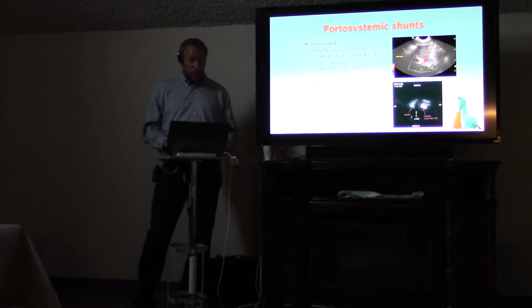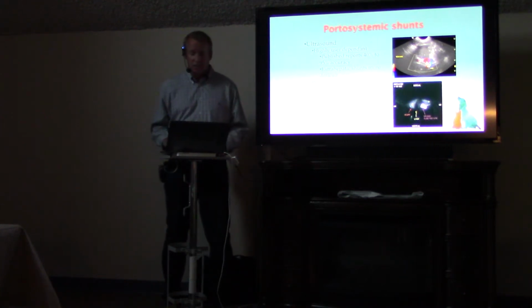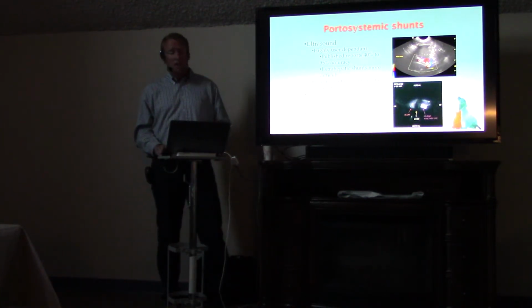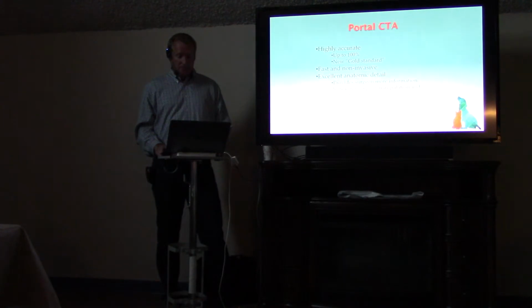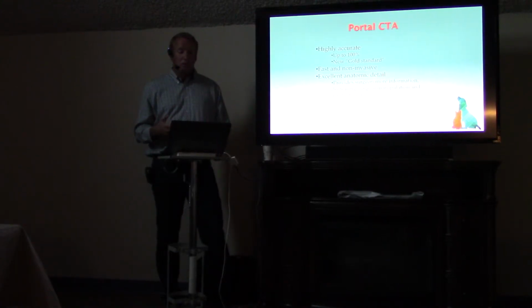Nuclear scintigraphy and portography used to be considered the gold standards for imaging shunts, and those have really lost favor recently. Now the gold standard for imaging portosystemic shunts is really portal CTA, or CT angiography.